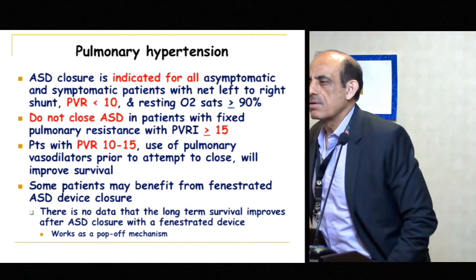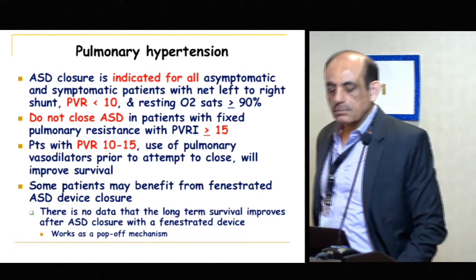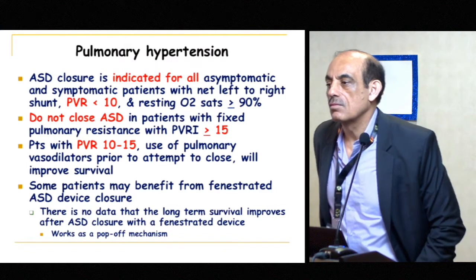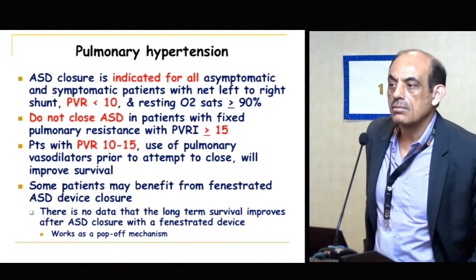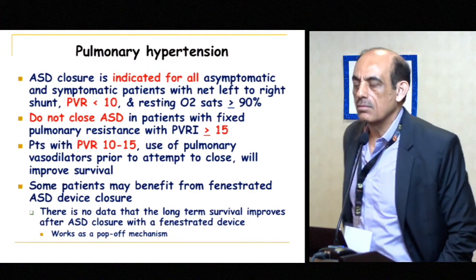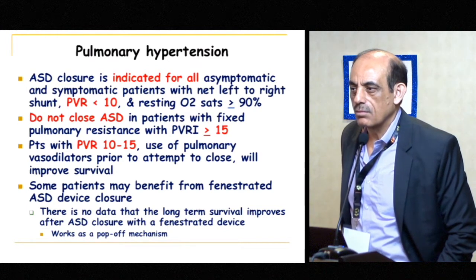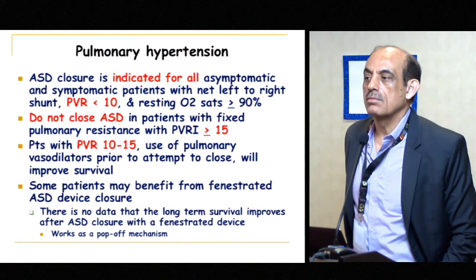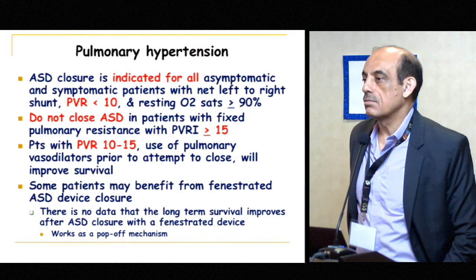John? Yes. So one of the things, this was back in, I guess, 2000 or so, when Craig Fleischman was with us in Orlando, he was doing a lot of our imaging in the interventional lab, and we noticed that when he put the TE probe down, and it's not just in small children, and you have the device, or you're trying to seat the ASO, the LA disc always went like this. Every time it goes up, down to the stomach, the LA disc turns.